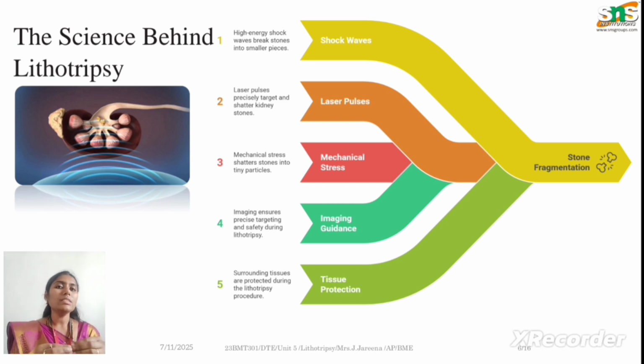The thing here is what type of energy we are using and how we are navigating that energy to the targeted area. These are the things we have to consider when we are designing such a lithotripsy, because we have to send a focused beam, align it and hit the kidney stone. Then only the kidney stone will break. So for aligning and focusing, we are using many things.